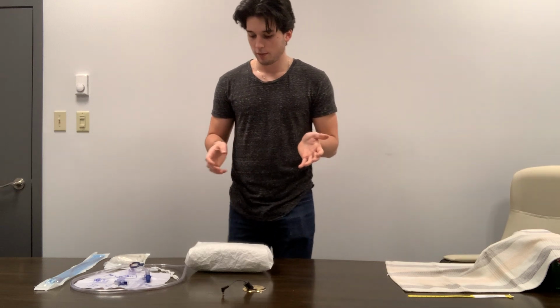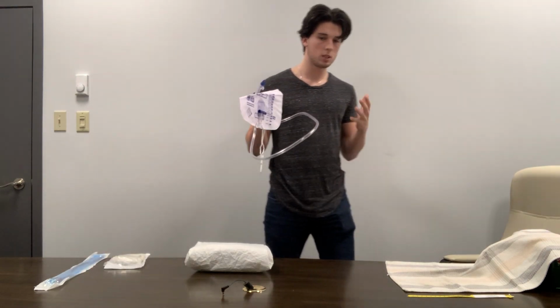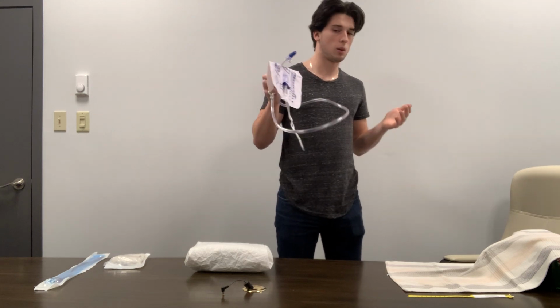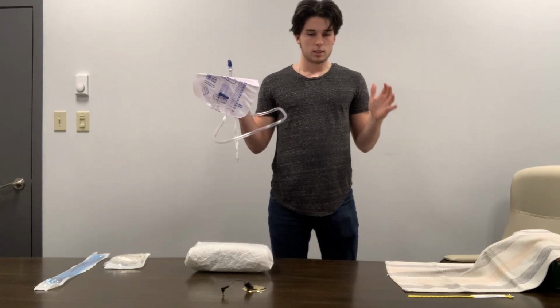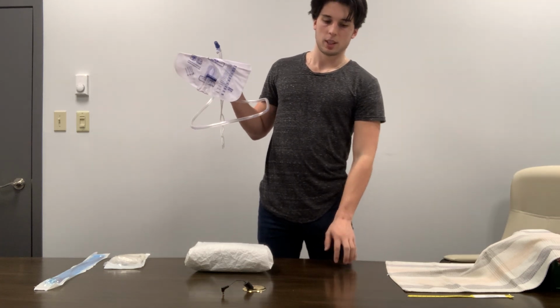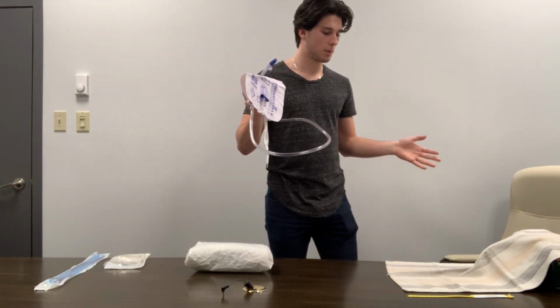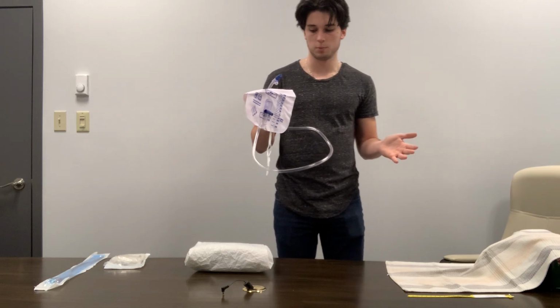So I'm going to start off by grabbing my drainage bag here. And now with this procedure, I'm going to make sure that I raise the bed as well as the table I'm working on up to my waist height to maintain sterility over my waist. In this demonstration, we only have a table that does not move. So I will be performing at this level here, keeping in mind that in a clinical situation, I would raise everything to my waist level.